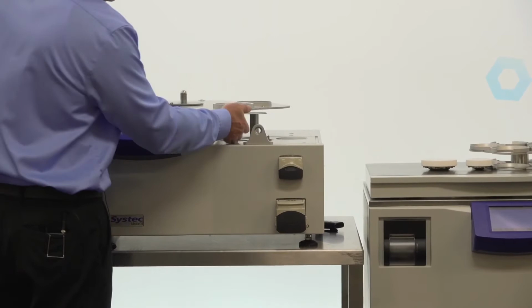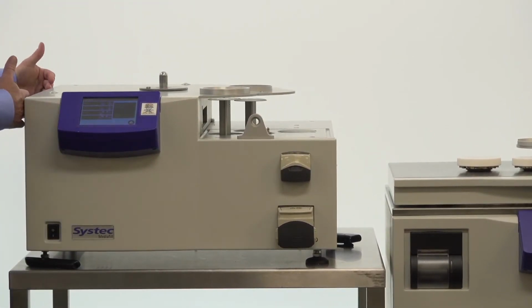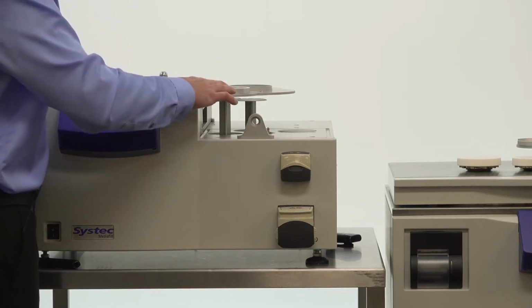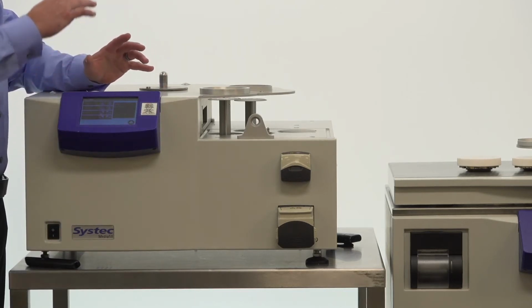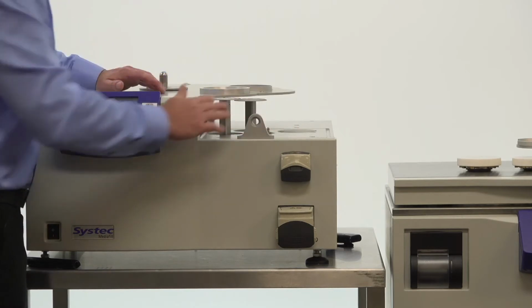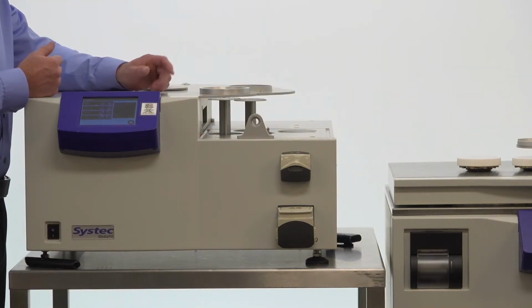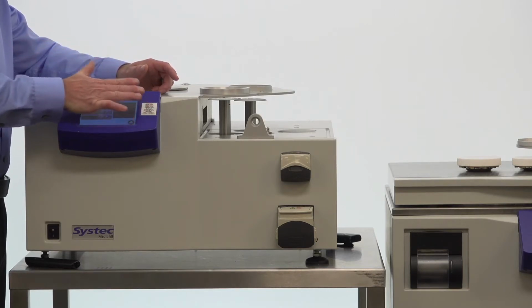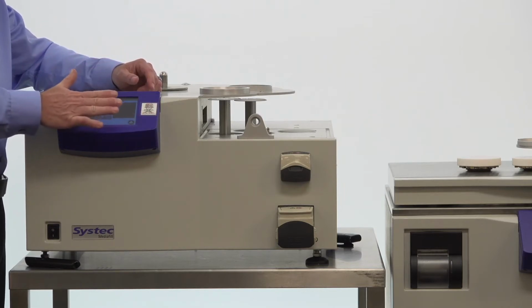And so now I can access this for cleaning. The system is completely sealed with the board to operate this unit housed vertically here. So there's really no ability for us to get any liquids into the system or any cleaners, as the entire system is completely sealed. That being said, we can clean this with any type of antimicrobial or sporicidal cleanser that we want to use. We just don't recommend that you spray anything directly on the screen. You would spray that onto a cloth and then give that a nice wipe down.